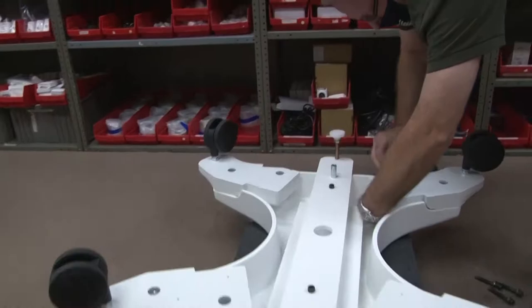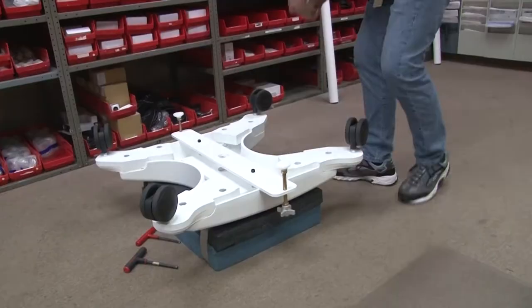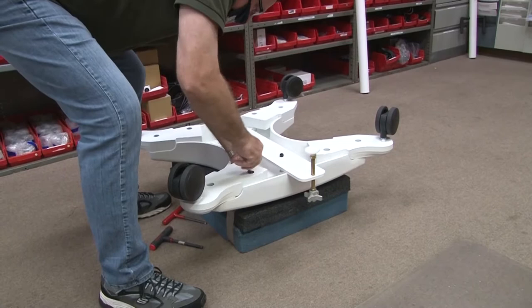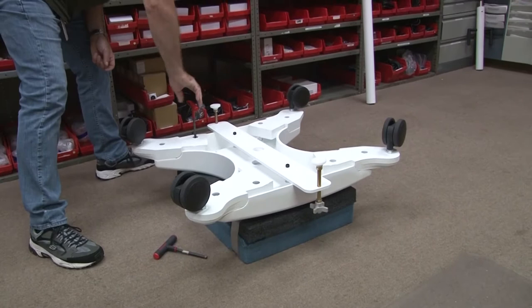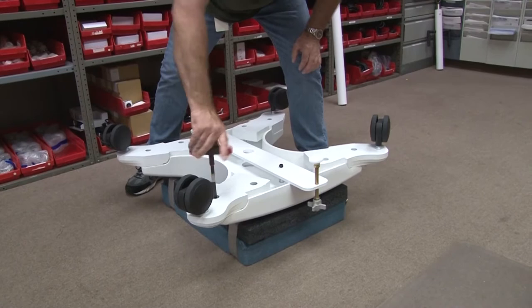Then place a spacer. Tighten the smaller bolt first, then tighten the large bolt.